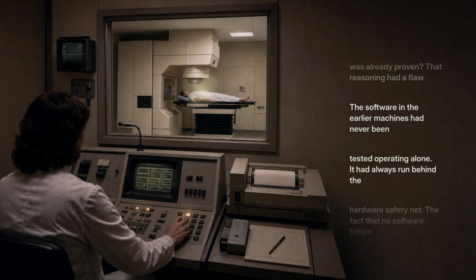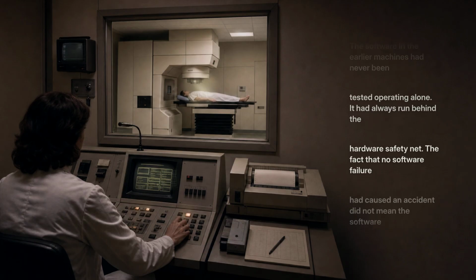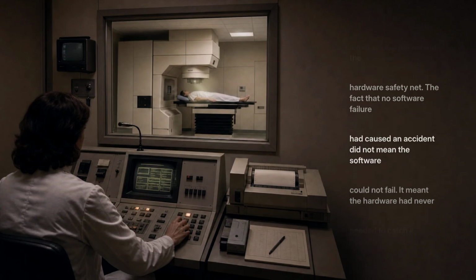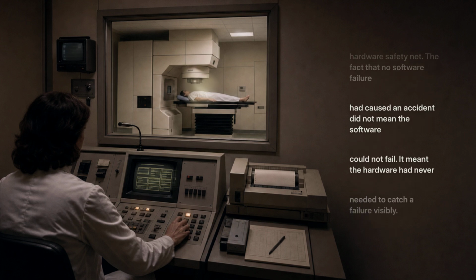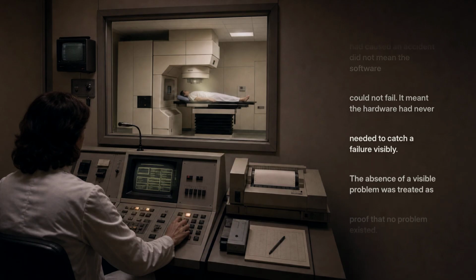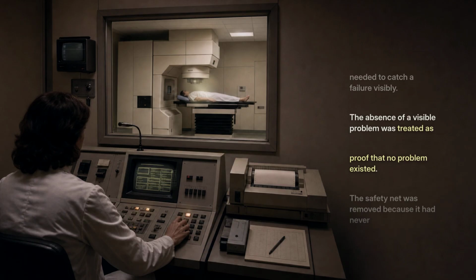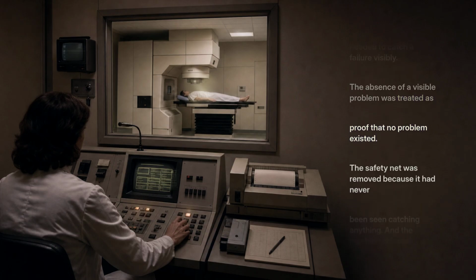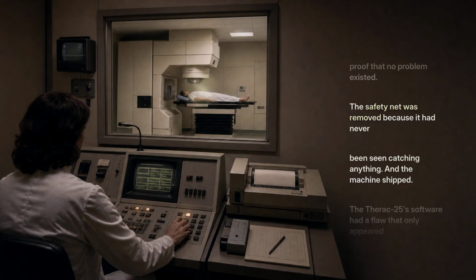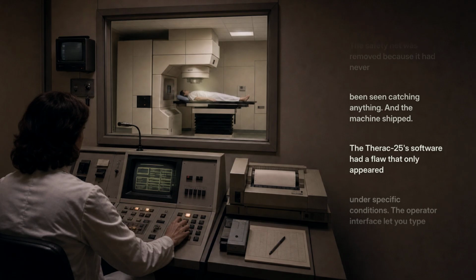That reasoning had a flaw. The software in the earlier machines had never been tested operating alone. It had always run behind the hardware safety net. The fact that no software failure had caused an accident did not mean the software could not fail. It meant the hardware had never needed to catch a failure visibly. The absence of a visible problem was treated as proof that no problem existed. The safety net was removed because it had never been seen catching anything, and the machine shipped.